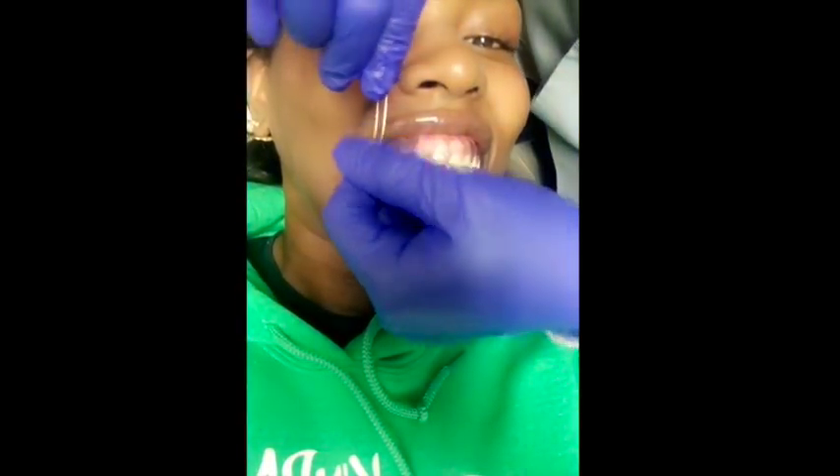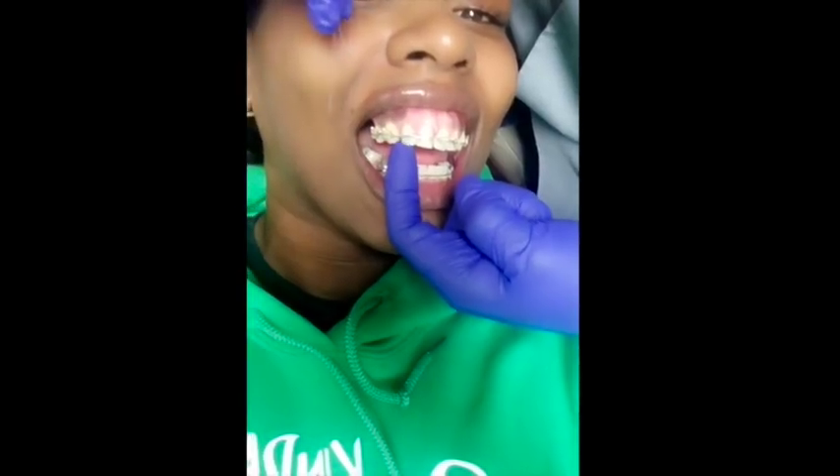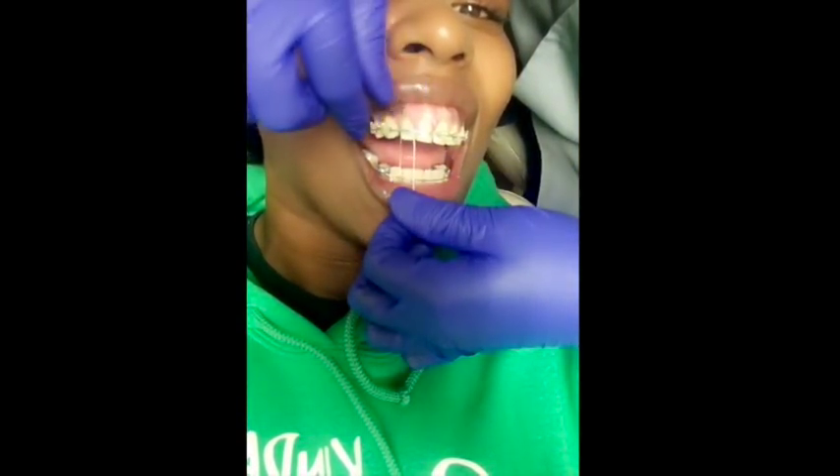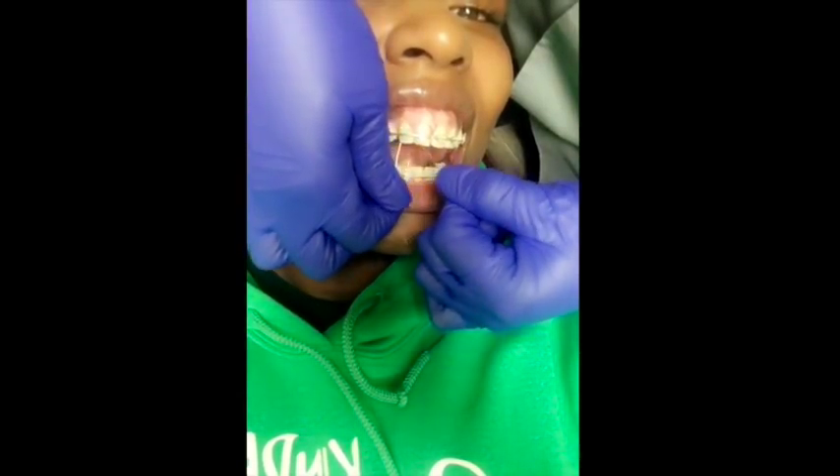Not only did I realize I was getting my bite plate taken out, which I was excited about, but I also realized I was going to have to get some hooks installed so they could put on some bands. This hook goes up here — and of course you feel a lot of pressure with it because you already have the space right here. When you leave today, I want you to take something.